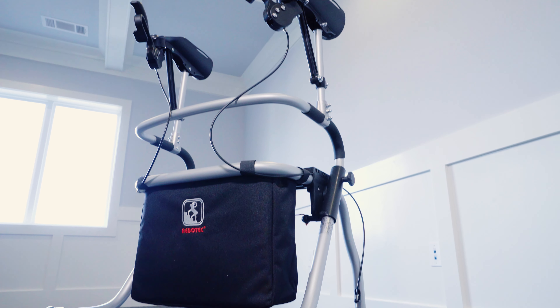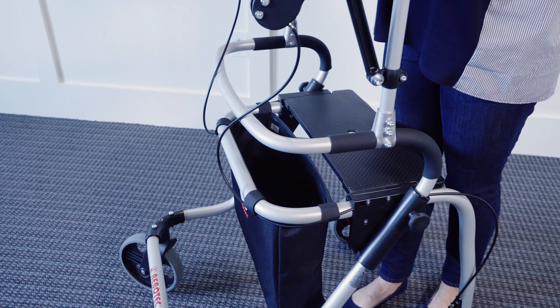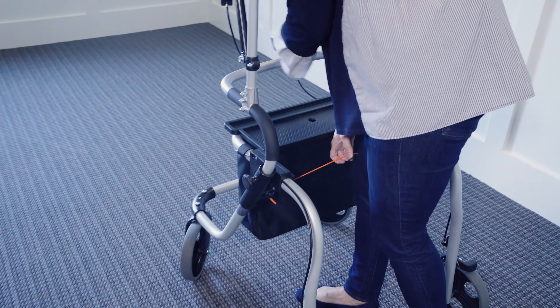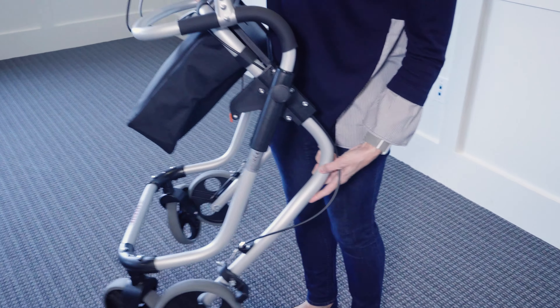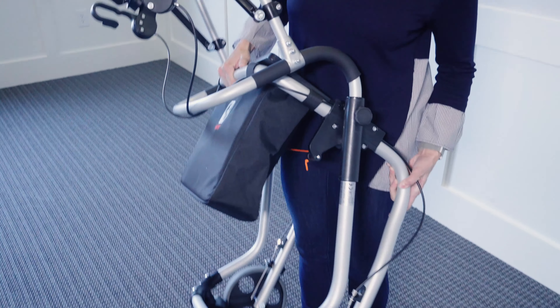It has a great walker bag — actually a lot of walker bags aren't very functional, but this one happens to be. This walker is easy to collapse: you just pull the string and lift up. It collapses fairly compactly, considering most forearm platform walkers are quite cumbersome.